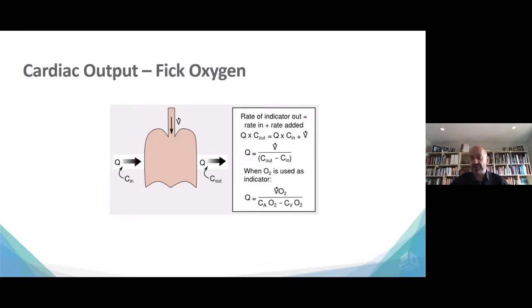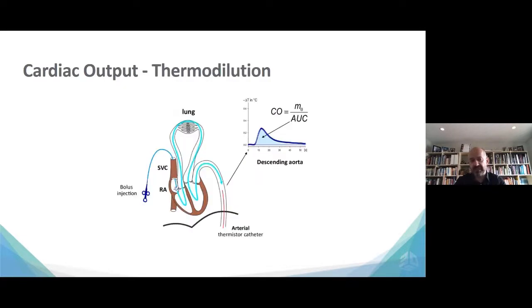There are 2 ways of doing this. You can draw the blood and get pulmonary artery saturation, or some of the PA catheters have a little oximeter probe at the tip, so you can get continuous pulmonary artery saturation. Both work well. The fancy Swan has an extra cable on it, but that will give you a cardiac output, and you can continuously measure this if you have a pulse oximetry probe on the Swan-Ganz catheter. The next one is called thermodilution, and that's on the next slide.